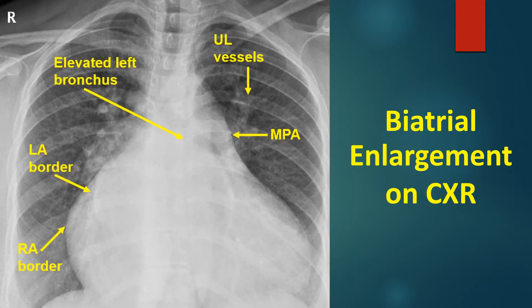The surgical procedure is seldom done now because balloon mitral valvotomy is the procedure of choice for symptomatic mitral stenosis. Summarising the findings, there is evidence of biatrial enlargement, pulmonary venous and arterial hypertension, and right ventricular hypertrophy. Together, these findings can occur in severe mitral stenosis.